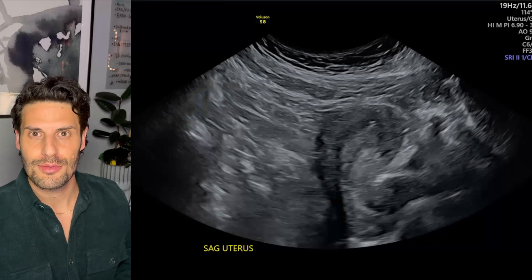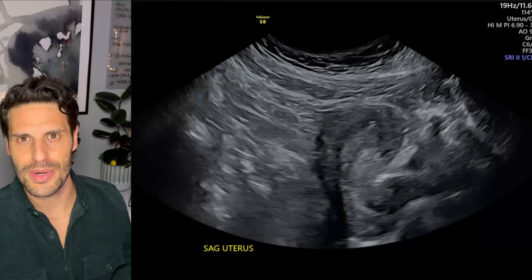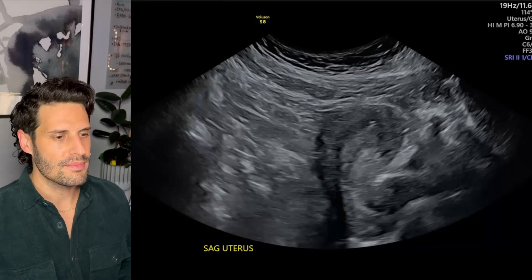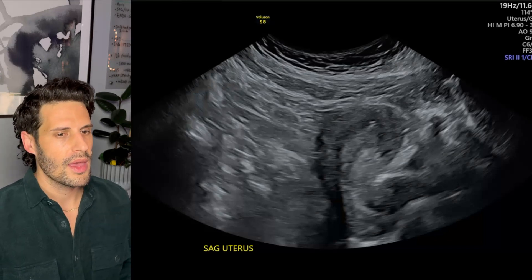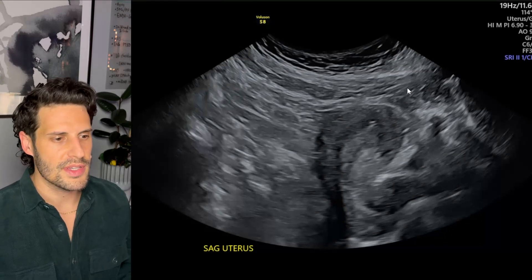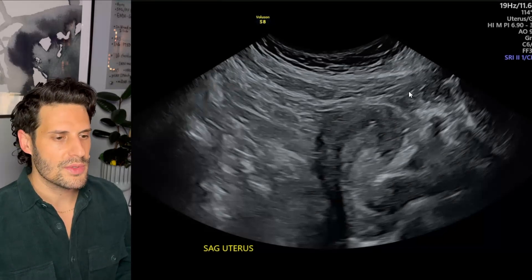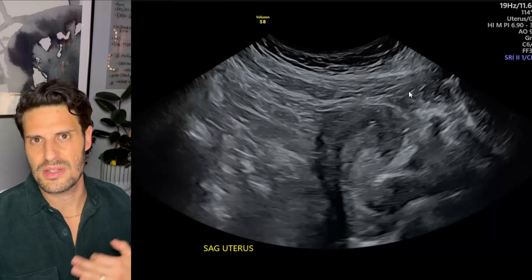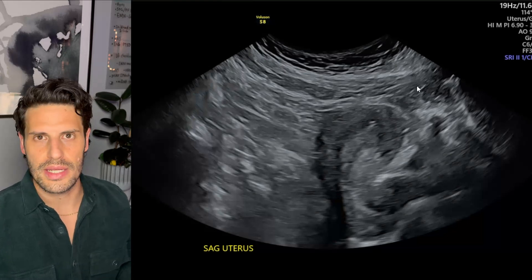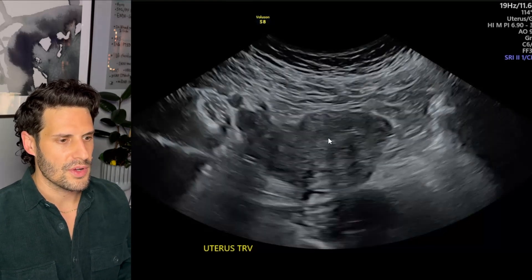When something is incorrectly positioned, that is when I will want to characterize exactly how it is incorrectly positioned. As we can see from image number one, we have transabdominal views with an anteverted uterus here. We don't require a full bladder for our transabdominal ultrasound, as it is very uncomfortable for patients and often doesn't provide much additional clarity — most image quality comes from our transvaginal pictures. Here's the uterus in transverse.